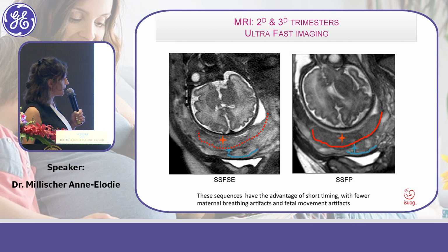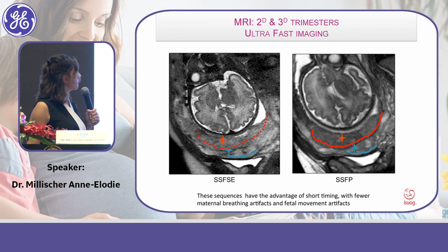underlying the placenta. Và một cái đặc điểm cũng tốt của cái MRI nữa là nó có một cái độ tương phản tốt giữa bánh nhau và cơ tử cung. Nó có một cái giới hạn giao diện bề mặt giữa hai cái này khá là rõ.